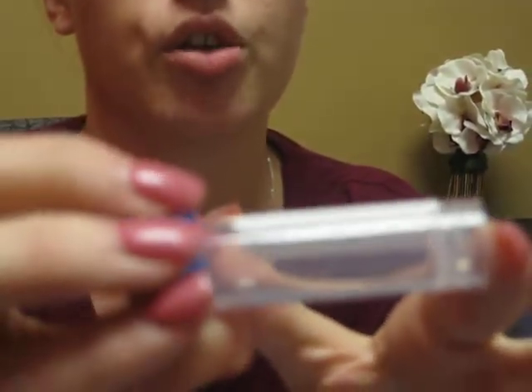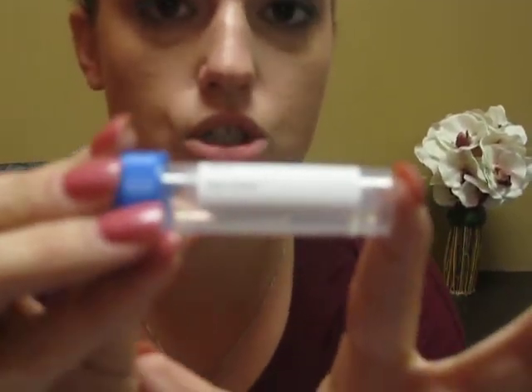You're going to make sure you put your name and your date of birth on all of these before you get started. So you're going to probably spit in them.